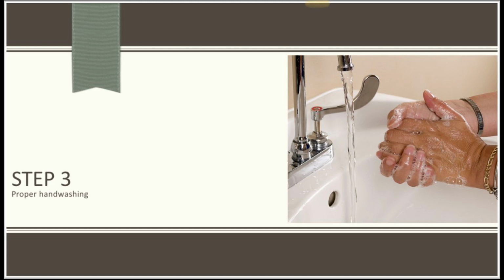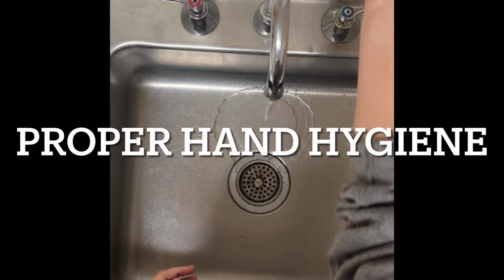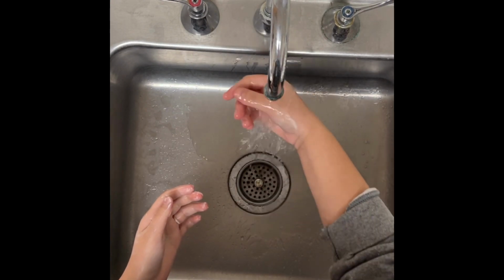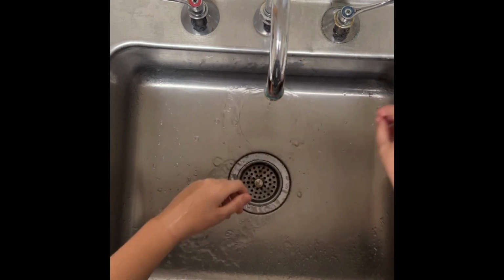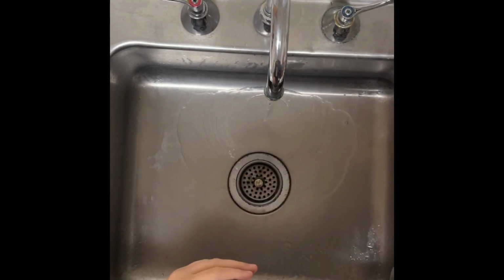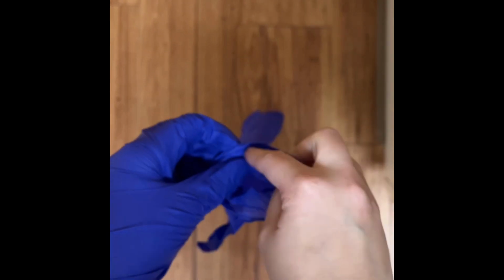Before any patient interaction, you should always be having proper hand hygiene. This includes a 15-second hand wash. For demonstration purposes, I have sped up my hand hygiene. Along with hand hygiene, you should always put on a pair of gloves before interacting with the patient.